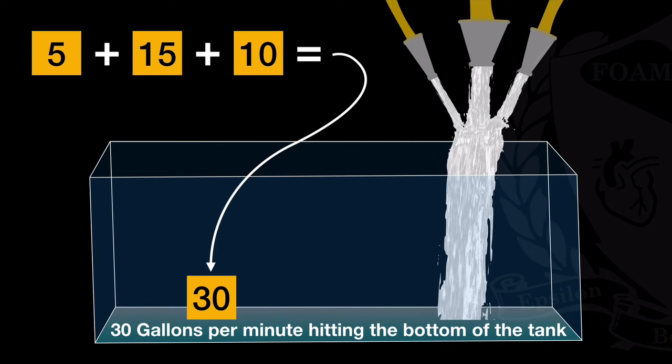So that's just like our patient. What's going on there is that we have two devices that might not be running at 30 liters per minute, but what they are delivering is what's hitting the bottom of the tank. And so if you were to look at how many liters they both deliver, they're delivering 30 liters into a given space at the end of the minute. And so their speeds actually are additive when you're looking at volume being delivered.